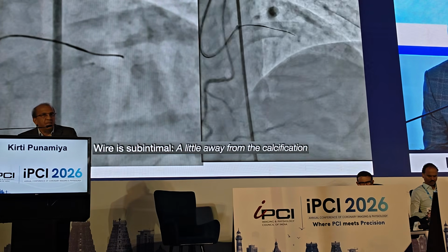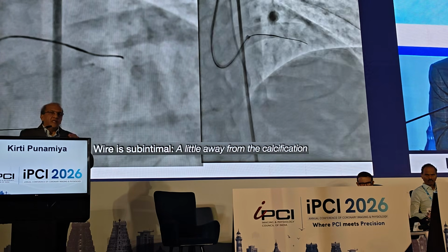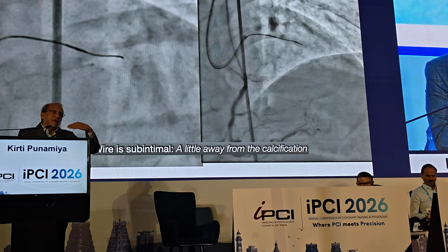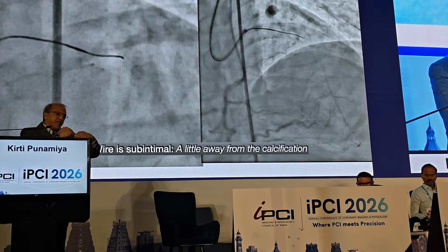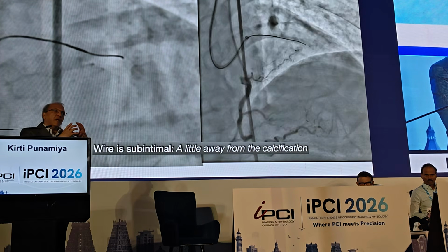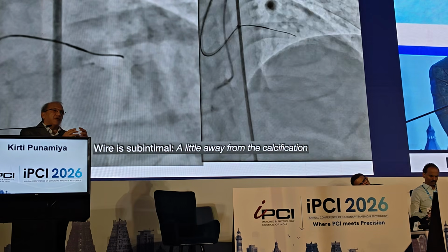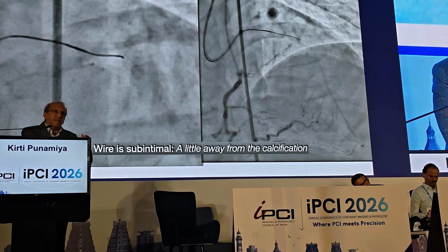the calcium. Now what is interesting, and I want to take you back, is that in the CT, you can take cross sections of your CT at various levels, and you can predetermine the relationship of your lumen to the calcium.